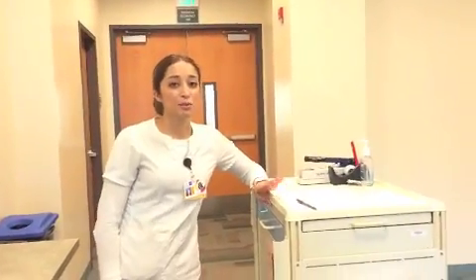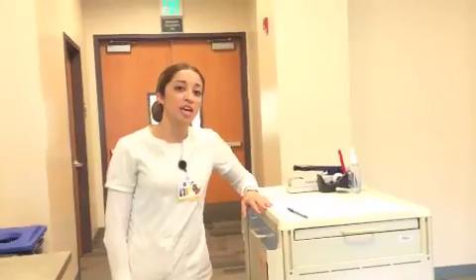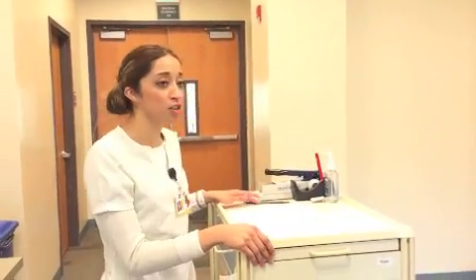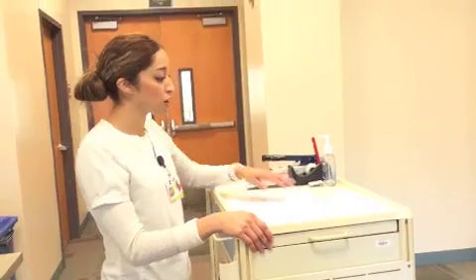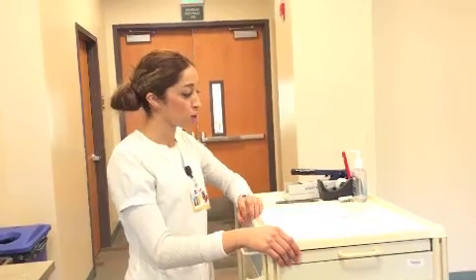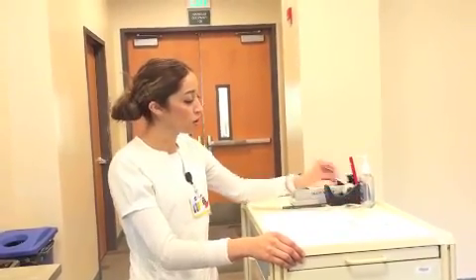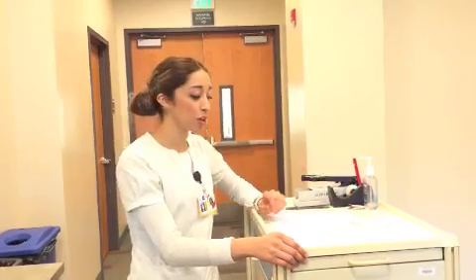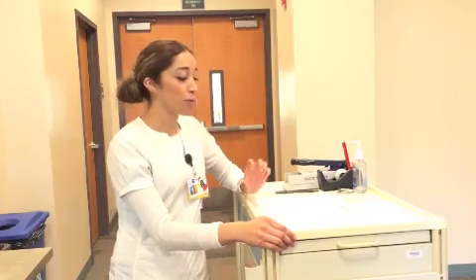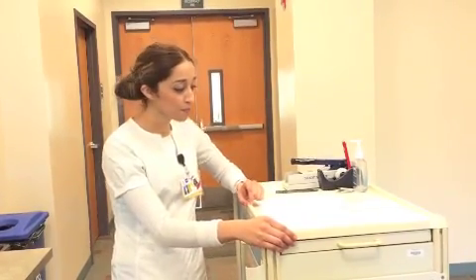I am going to be demonstrating how to administer an ID injection. You want to gather all your supplies. So you will need your MAR, your physician's order, and some alcohol prep pads. You'll need the syringe, the needle, and the actual medication for the PPD.